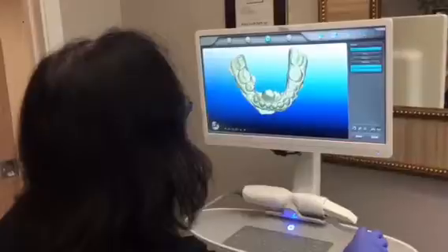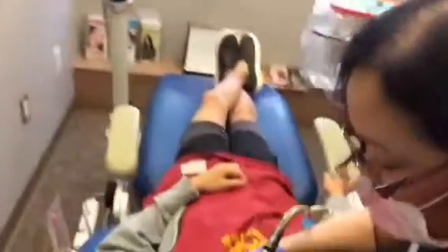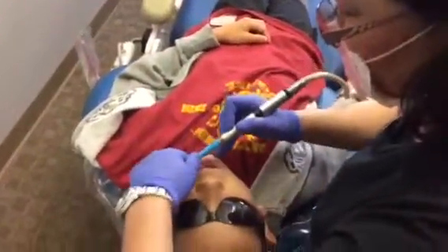That is not your tongue. Many cases like this actually, and you know what? I'm happy you're here today. Okay, head back. Now I'll stop the band. Swallow — head back. Connor, stay turned towards me, buddy, so I can pull your cheeks so I can see your teeth. This is called pumice — it's kind of pretty in a paste form.